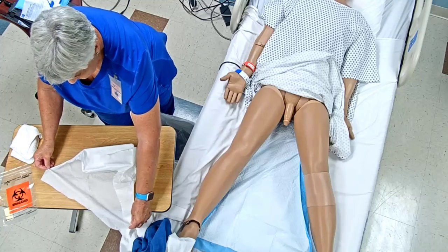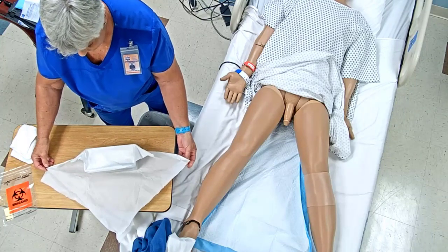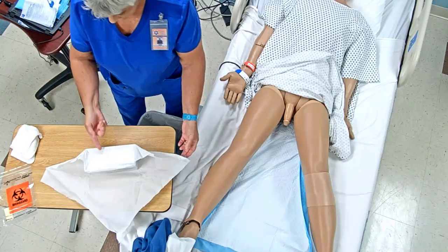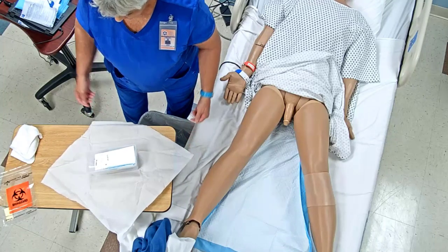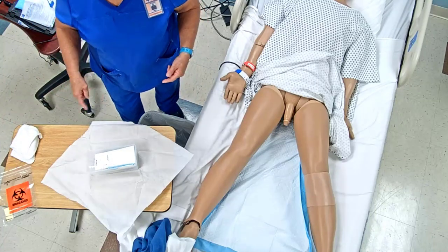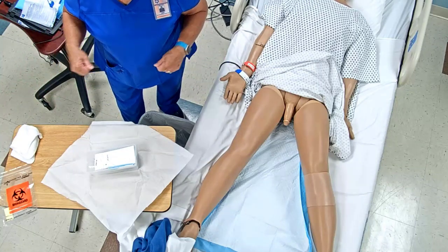Making sure you're just touching in that 1-inch border. You want to make sure that the drape is not folding back on itself. Okay. And just know that I've got a 1-inch border around here. Anything that's off the edge of the tray, just like with asepsis, is not sterile anymore.